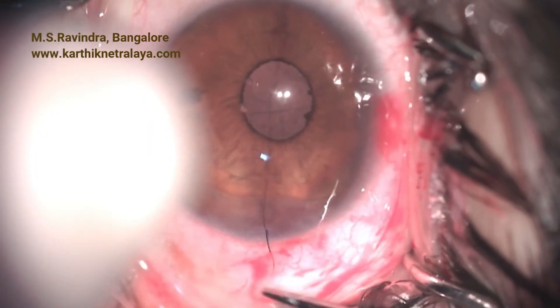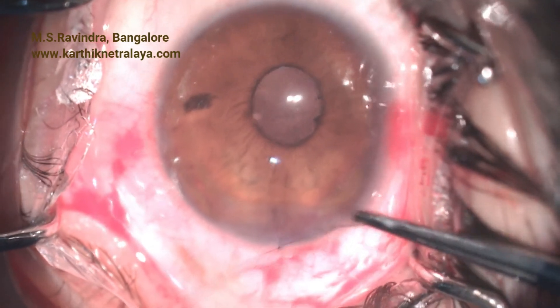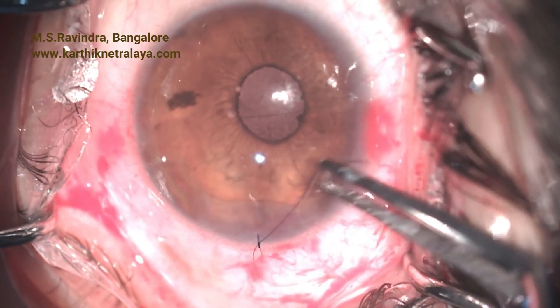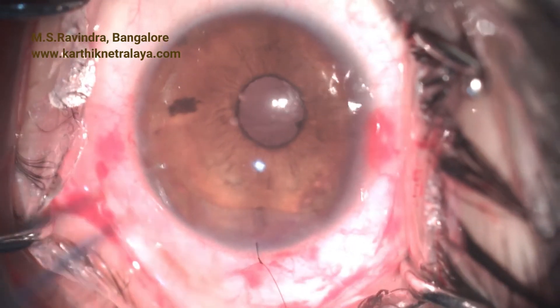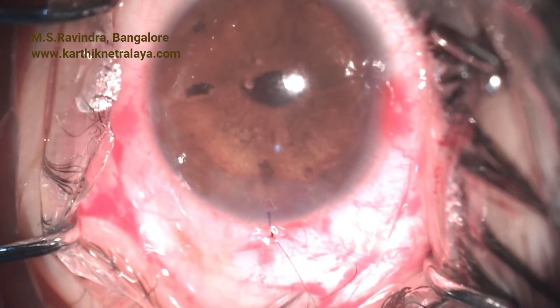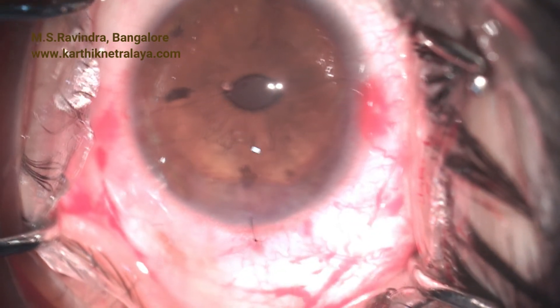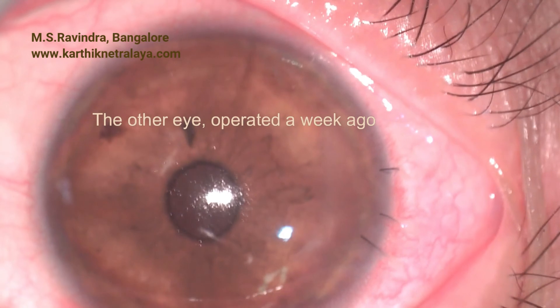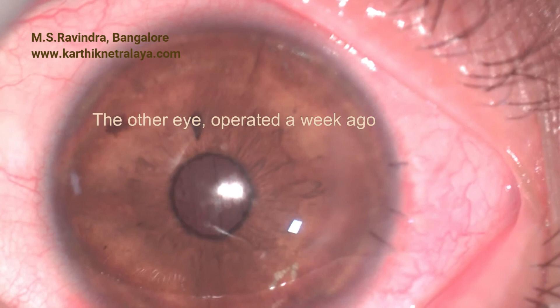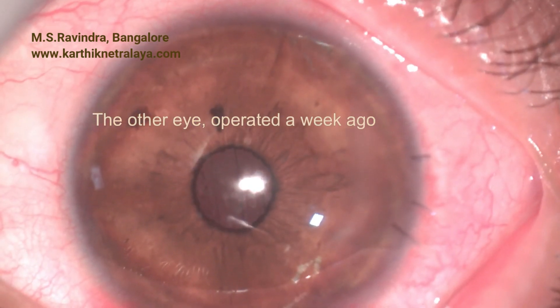We have been implanting retro-iris claw lenses for more than a decade now, and we don't have the problem of iris dispersion syndrome, glaucoma, or prolonged postoperative inflammation. This surgery was done under topical anesthesia along with intracameral infusion of 1% lignocaine. The eye does not have to be bandaged at the end of surgery. This eye was operated a week ago and the patient has done extremely well. In this eye I had to put three stitches to maintain the chamber. Thank you.